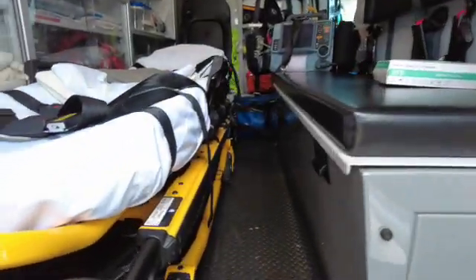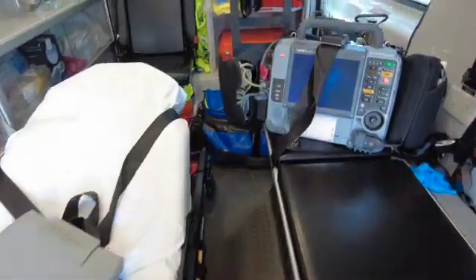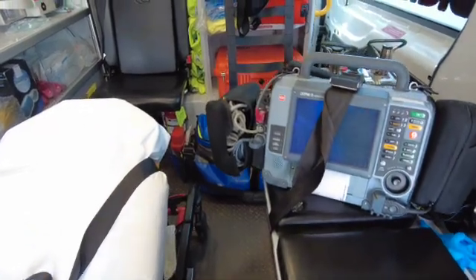Next, you have to enhance your own stability. Staying belted in usually isn't an option, so I stabilize my position by kneeling down between the stretcher and the squad bench. And I try to limit tremors or motions in my hand by resting my little finger on the extremity. How do you determine the best time to make the stick?